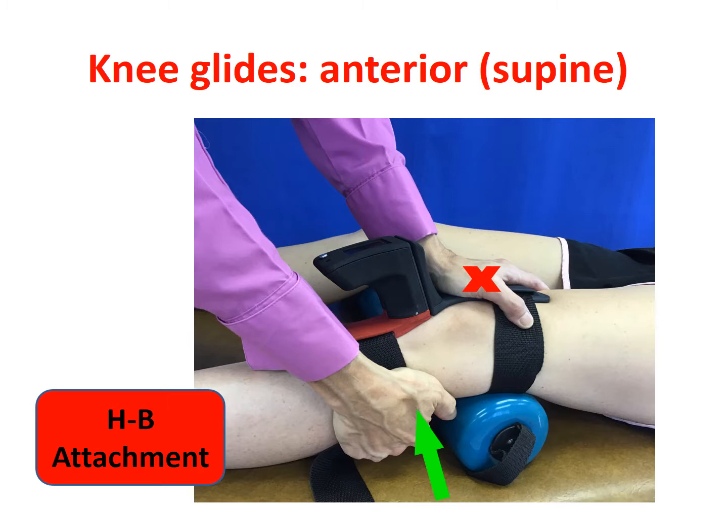To contour to the tibia, the most proximal attachment curves around and relieves the patella and then applies pressure onto the distal femur. The straps hold the device in place, and then one would anteriorly translate the tibia on the femur, just like you would in any other knee mobilization in performing an anterior glide. So the learning curve is very minimal. The technique is just the same as you would see with your normal mobilization technique.